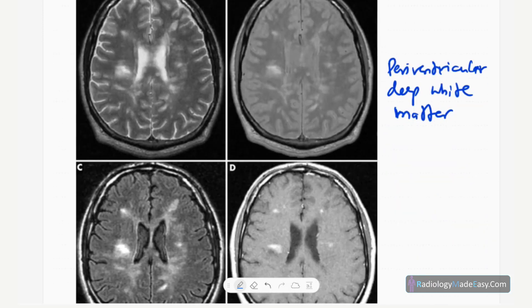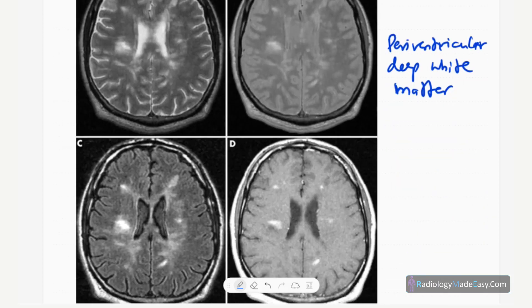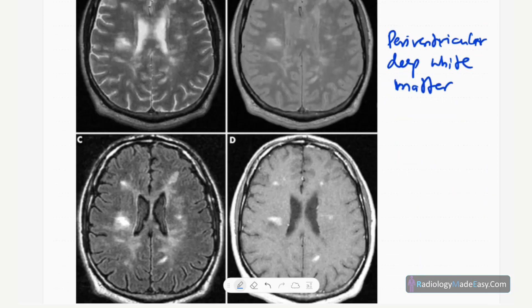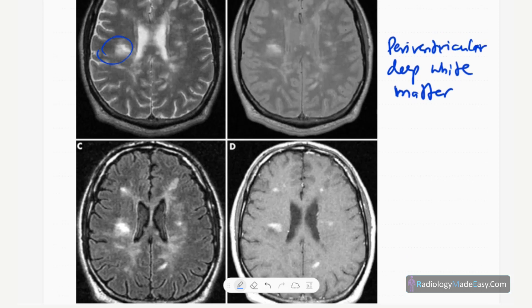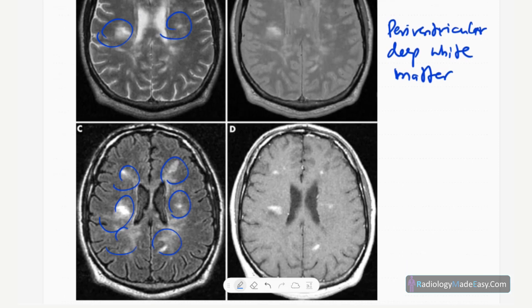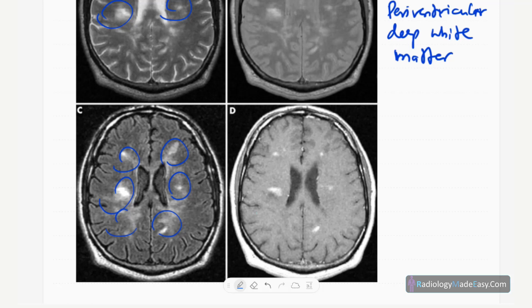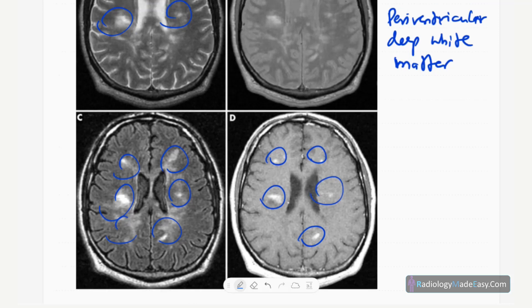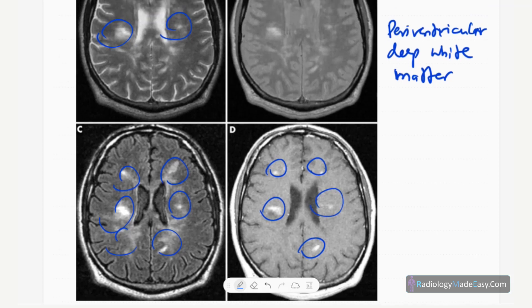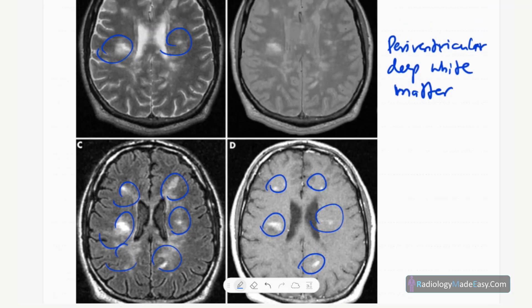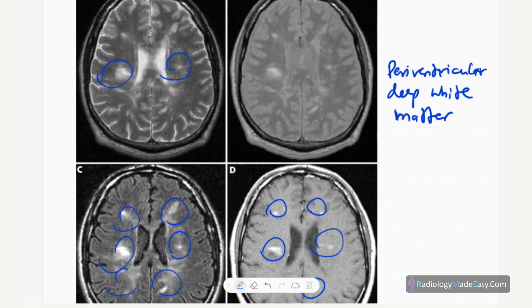Here are axial T2 and FLAIR images. You can see deep white matter high signal areas on T2 and FLAIR images. On T1 contrast-enhanced images, you can see some enhancing areas — these are active lesions. Periventricular deep white matter involvement is the commonest presentation.